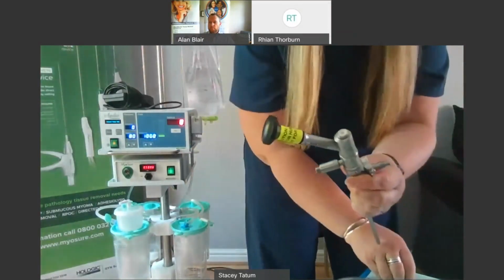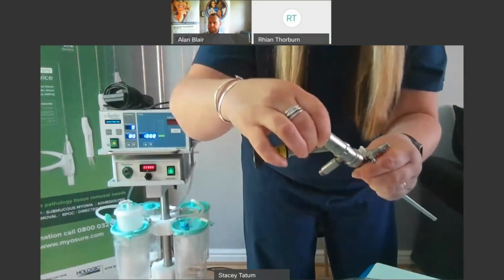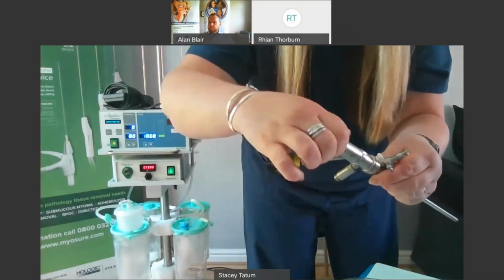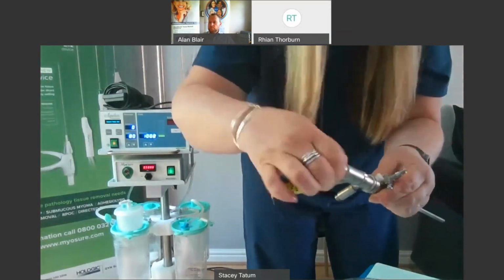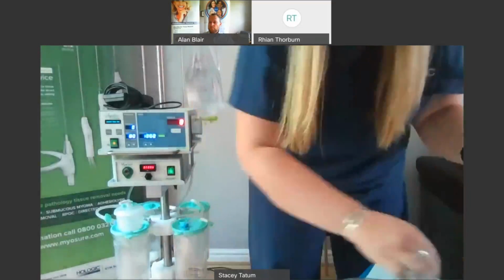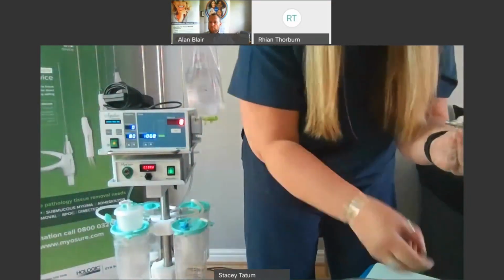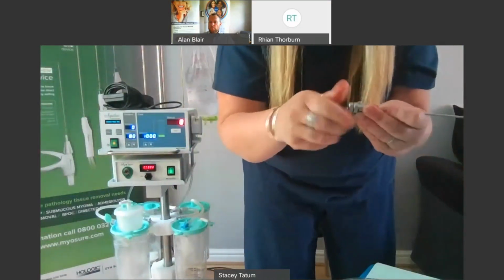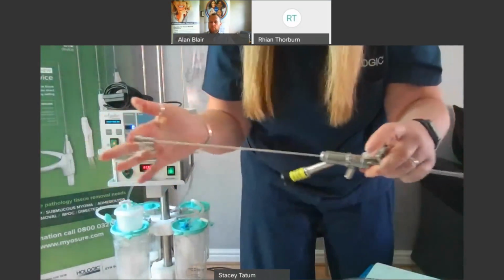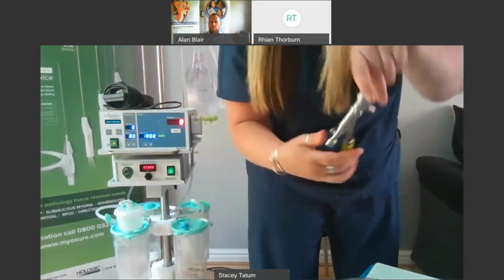Then put an end cap on the end of the scope, and you would do the same for the outflow channel. These scope seals are going to stop any fluid coming back out of this end of the scope, but they also give a little bit of traction as you slide the outflow channel down the scope, because this doesn't lock into place like some scopes, but it will stop it falling out for you.